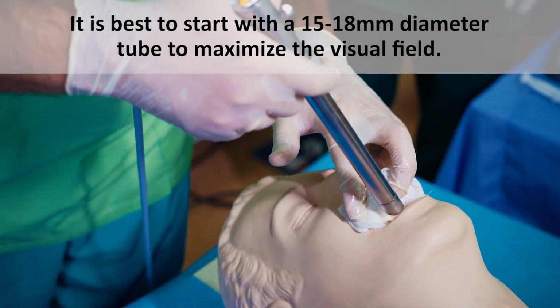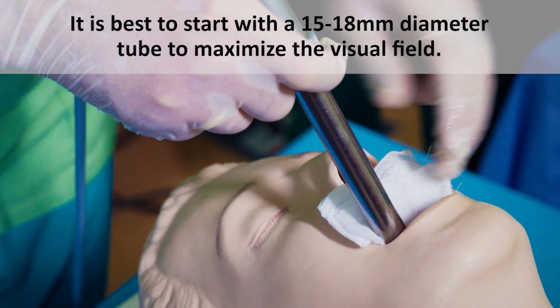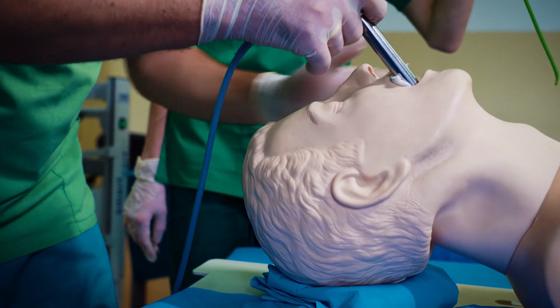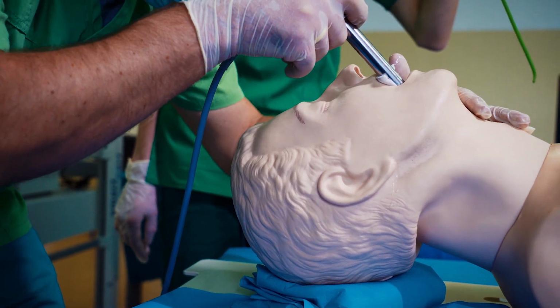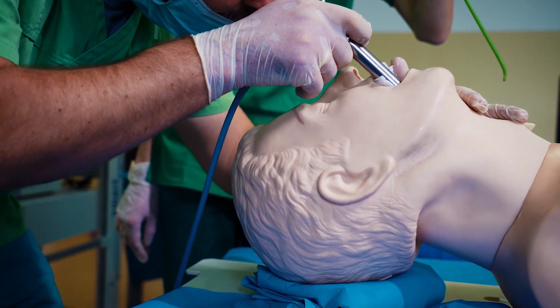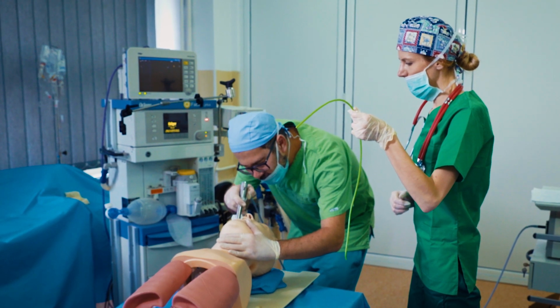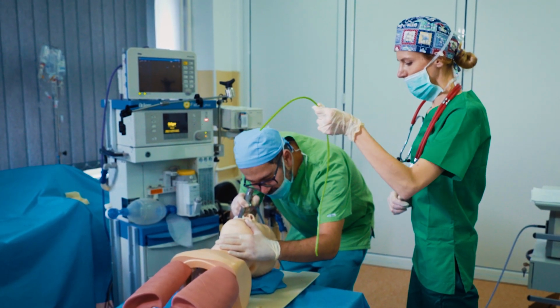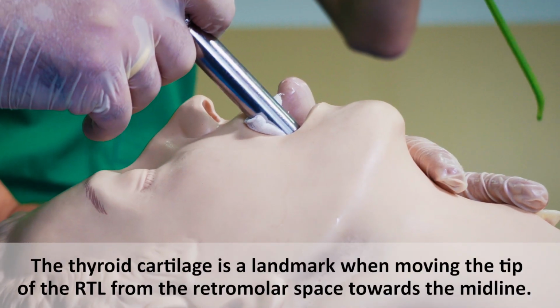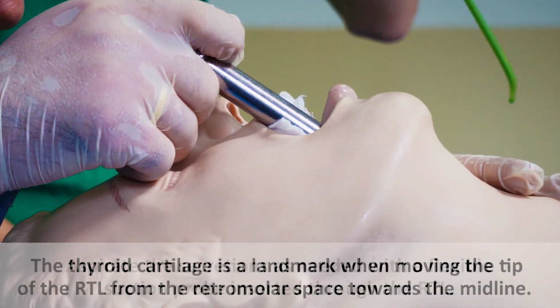Introduce the rigid tube in the oral cavity at the level of the right or left labial commissure with the bevel facing the superior arcade. The non-dominant hand opens the patient's mouth, hyperextends the patient's head, and the rigid tube advances towards the pharynx. The investigator applies gentle pressure on the proximal end of the rigid tube against the protected superior molars as the tip of the tube is reaching the hypopharynx. That way, the tip of the rigid tube orientates anteriorly in the direction of the glottis.